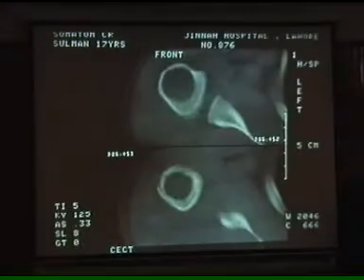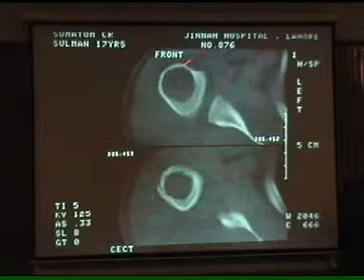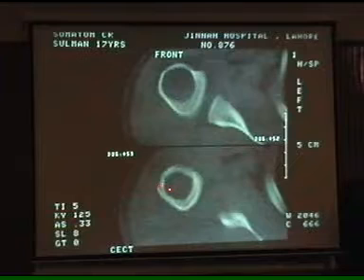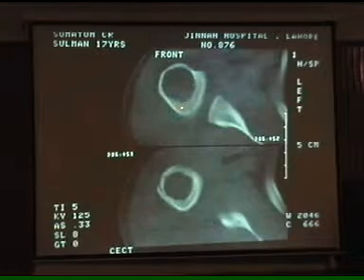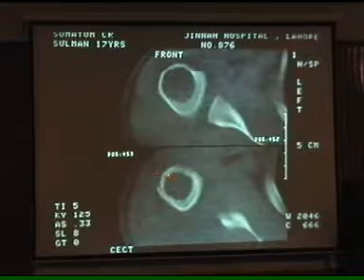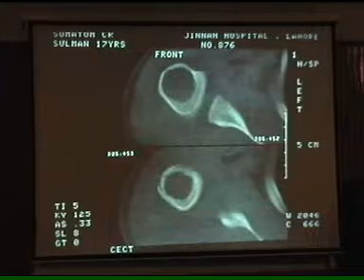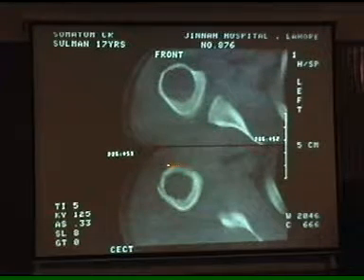We asked for the CT scan. If you look at the CT scan, that is the upper end of the humerus. In this area there is one fracture here, one fracture here, and minimal malalignment of the bones. One bone is being pushed inside, and that is all cyst which you appreciate. Normally the internal medullary cavity should look like this. But look at this hypodense area, well-defined with smooth outline, with 2 sites of small fractures but no displacement. On X-ray, we couldn't appreciate if there was a fracture except the lucent area. But still he was complaining of pain, though with no displacement of the fragments there is normally not pain.